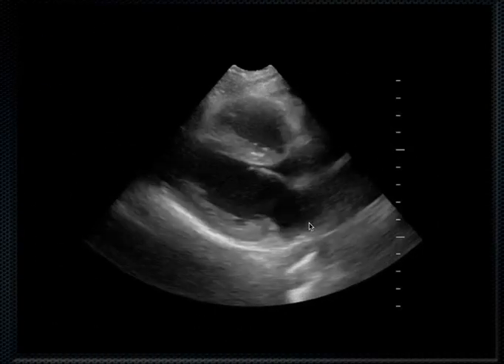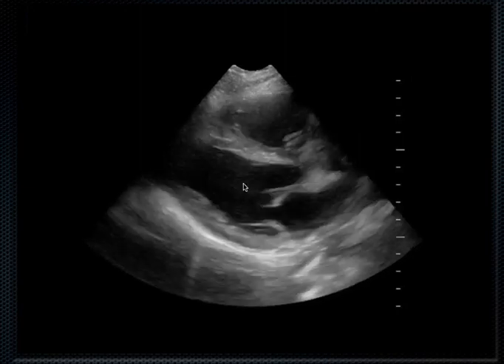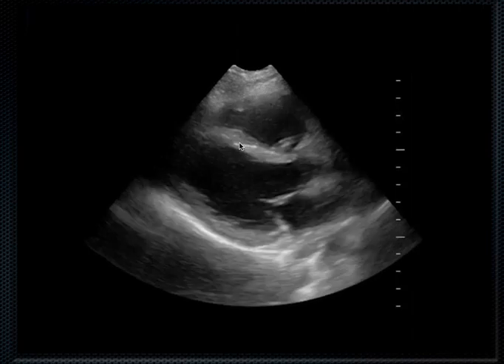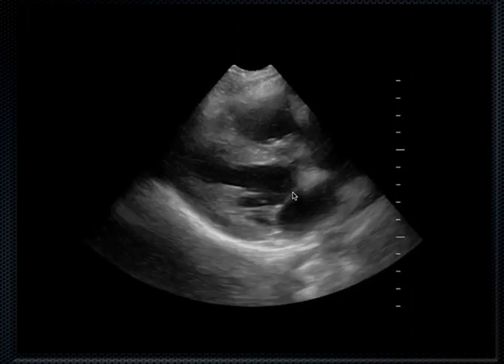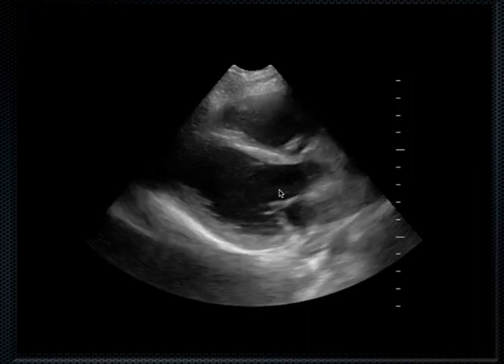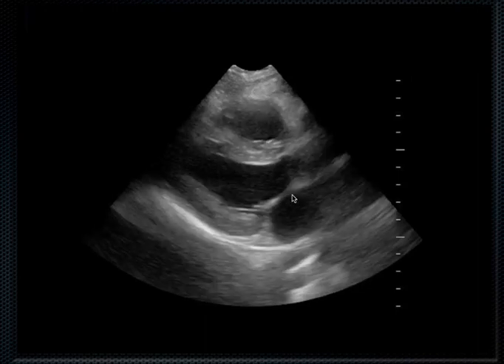And in real life, what we see on ultrasound is this. This is the left atrium, left ventricle, aortic outflow tract, right ventricle. Here's the septum. And we notice how that anterior septal leaflet of the mitral valve, I froze it for a second, is right here. Now watch as it goes through its range of motion. Okay, so here is systole. The heart's going to squeeze its blood right out the aorta, and as it does so, the mitral valve is closed. Now if I move along here, you'll see the mitral valve will open during diastole.